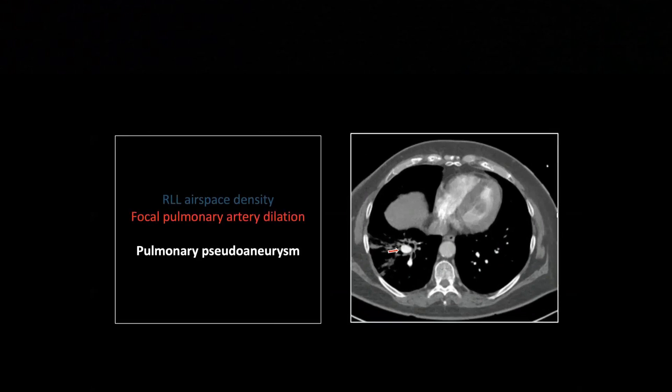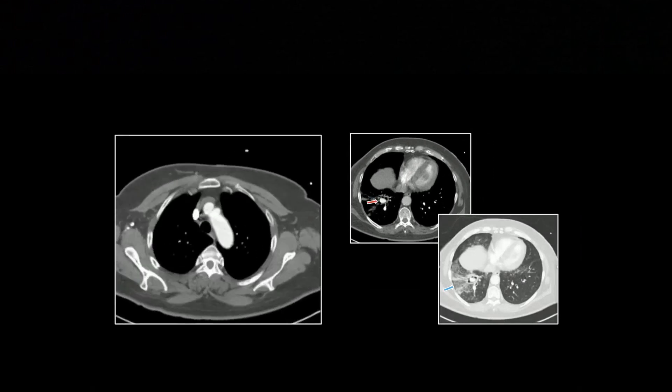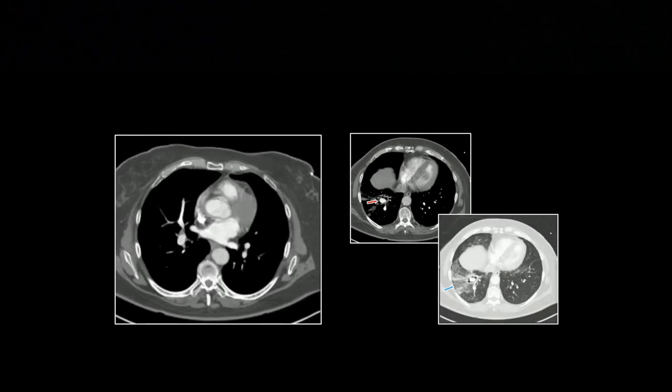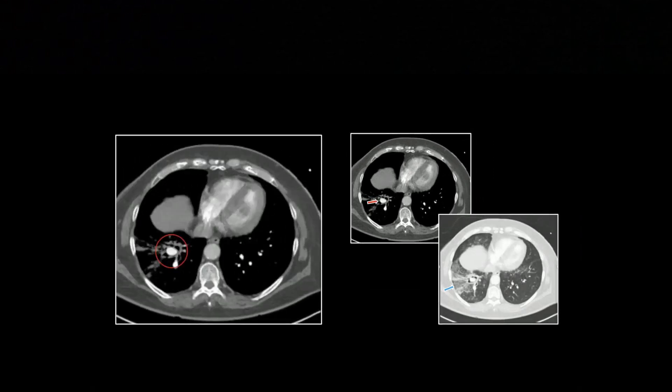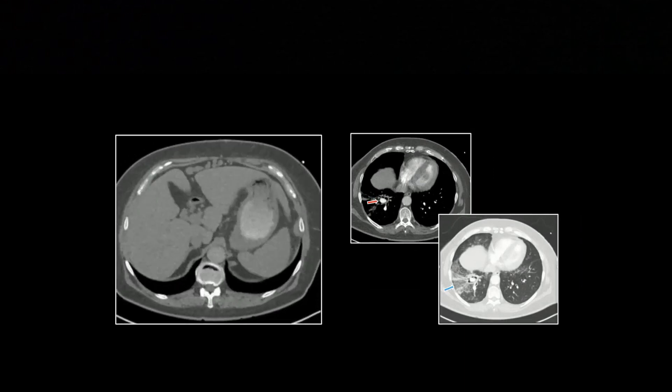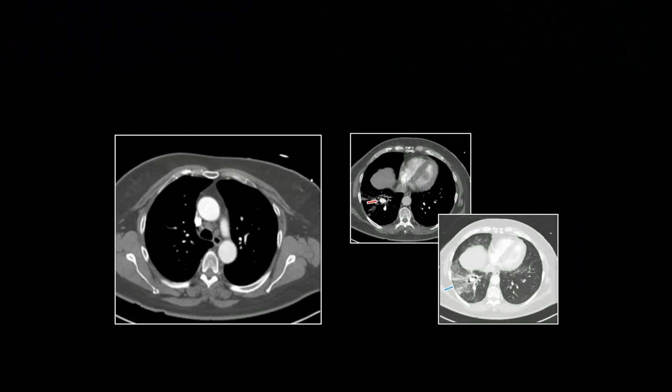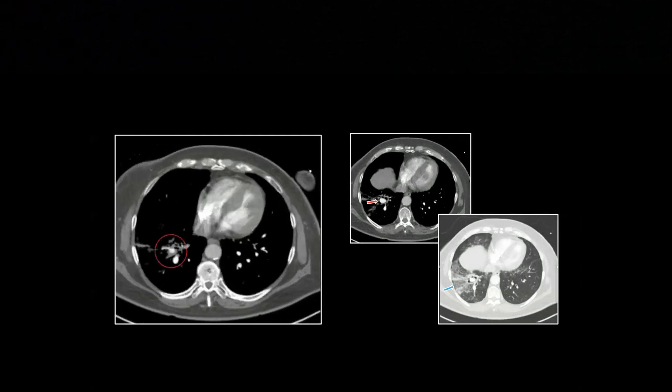But there is this focus of contrast enhancement, nice, well-circumscribed, rounded focus of contrast enhancement. This will happen in these destructive pneumonias where you develop, it essentially eats into the pulmonary artery and you develop a pseudoaneurysm there. If you watch that, it doesn't lead anything. It's sitting right in the middle of that focus of lung destruction.